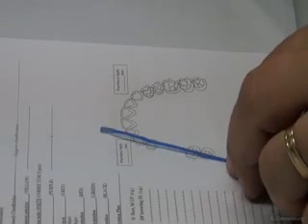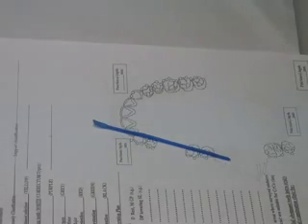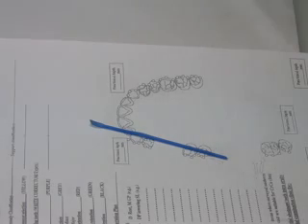Do I need to add components here? Why? We have 2 reasons to add, either because of indirect retention or because of cross-arch stabilization. What do I need here? I need both. So, I need indirect retention because this is my principal fulcrum line between these 2 rests. So I have to extend somewhere here. And I need cross-arch stabilization. I need 2 clasps. I have 2 clasps here. I need 2 clasps here. I need that support to go to the other side as well. I need some reciprocation from the other side and stabilization. So I do extend to the other side.